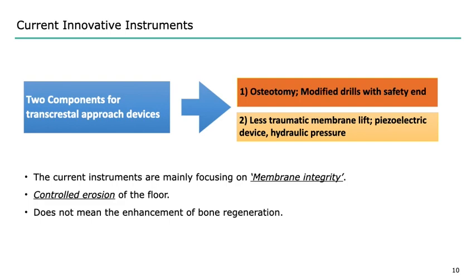Piezoelectric device was also developed, and nowadays hydraulic pressure lift has been popular to prevent any accidental perforation. So this kind of hydraulic pressure is now kind of a game changer in terms of the transcrestal approach method.